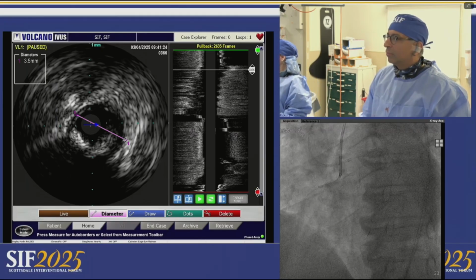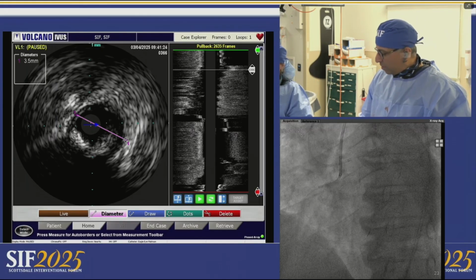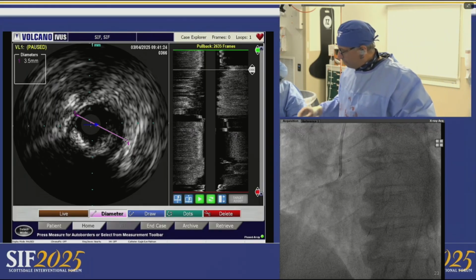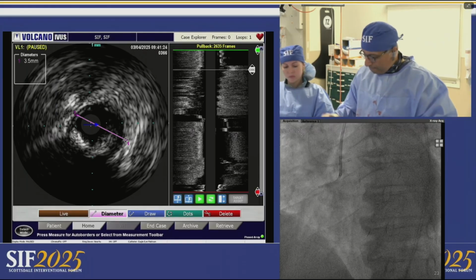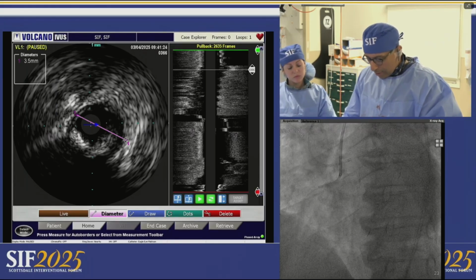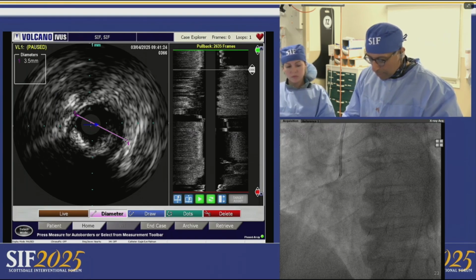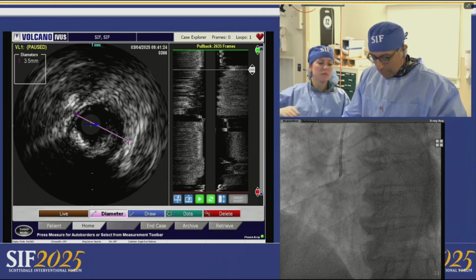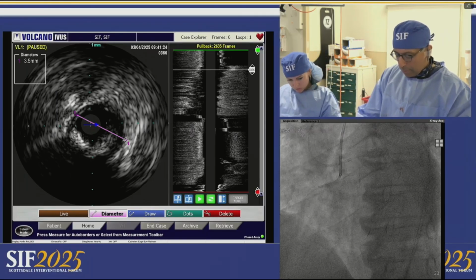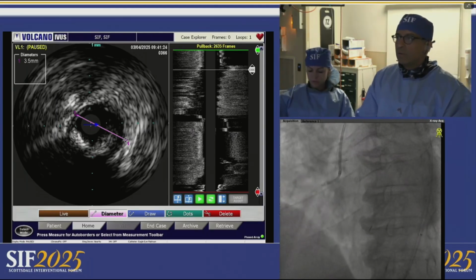And you know, again, we've talked about it. I talked about it in my clinical trials. Imaging is essential for these cases, whatever you've got, and you've got to put the right size product in that's going to grow to the right size so that you actually get drug delivery and a result that's going to be durable. So you're not going to put a 2.5 stent distally and make it grow to 4.5 in most stent platforms. And so all this becomes very important. It seems simple, but you just got to keep it straight.